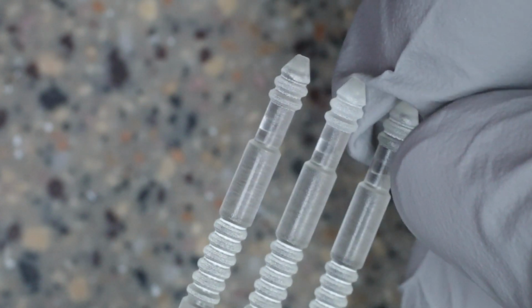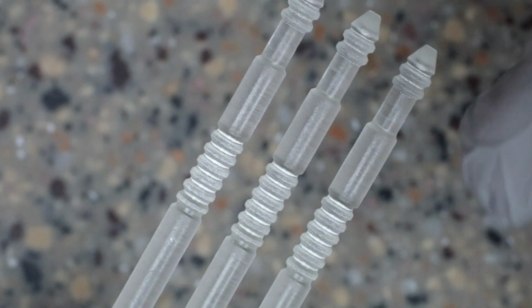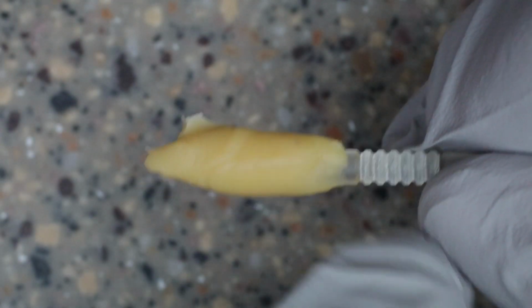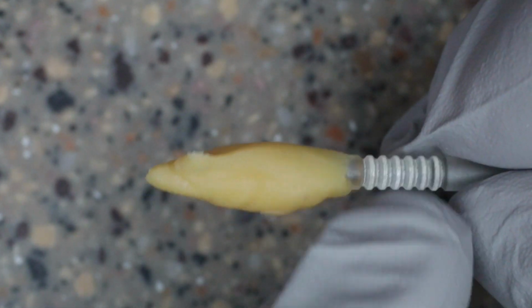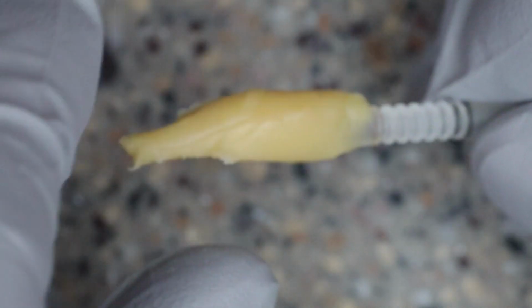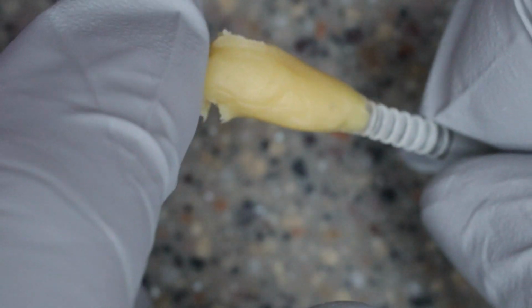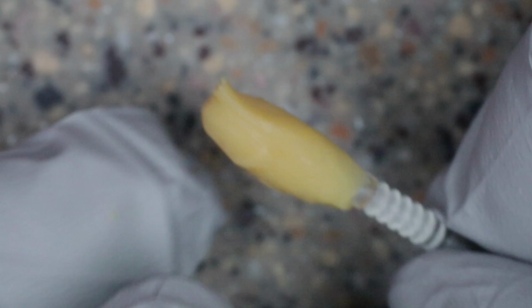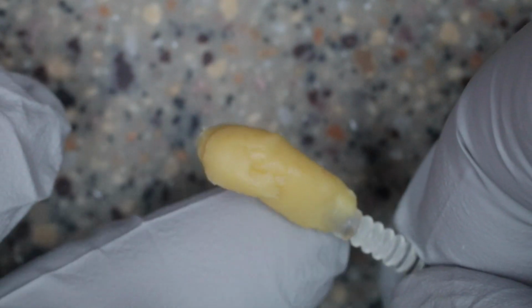There's also these little pins here, or these little pegs, I guess you could say, that you put the material on one of these and then you stick the crown onto the material. So let's see what that looks like. So here I have some of the material onto one of these pegs, and this stuff is super sticky, okay? Like, I don't know if you can tell, but my gloves stick to this really easy. And whether you're wearing gloves or not, it's going to be sticky stuff.